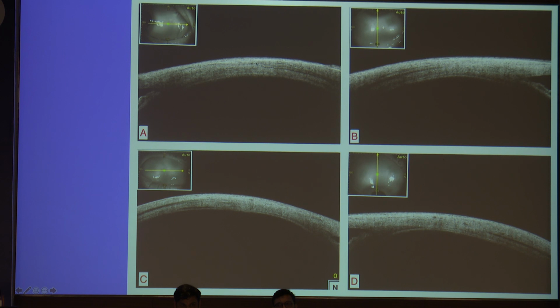You can see here, whenever you're looking for the muscle, the muscle begins as a tendon. So it is a thin hypointense layer which is going to assume a darker or thicker configuration. That is the transition from muscle tendon to the belly, right? So this is medial rectus and this is inferior rectus. You can see a slight tendinous portion which is becoming more of a belly, and the same applies to lateral rectus here, right? And the same applies to the superior rectus. Superior rectus has more bulkiness, that's why we are able to see a belly. So this is how we need to identify the normal rectus muscle.